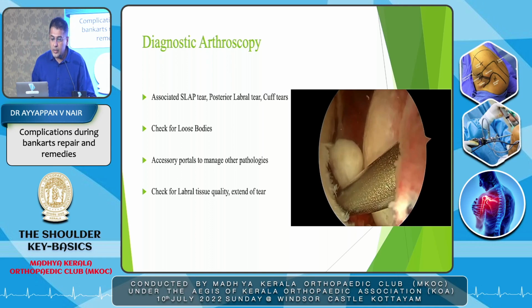and once it is coming, you can take it to the anterior. Another problem you find when you take out a loose body is the soft tissues, because when you're taking it out, it gets stuck in the soft tissues. The port through which you're taking it through the soft tissue should be wide enough. Put in a nice artery, open it up nicely, and then twist it around and take it out. That's another thing you do.